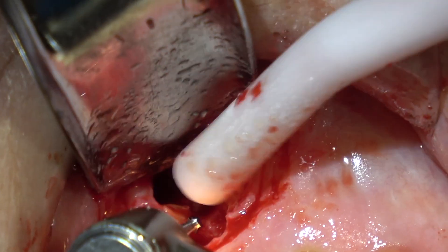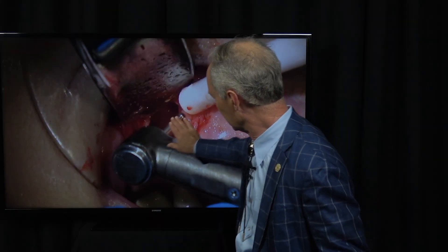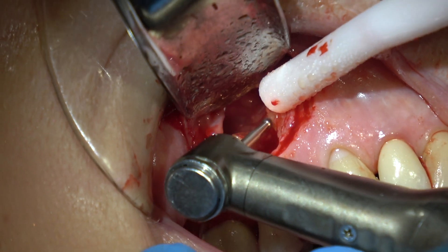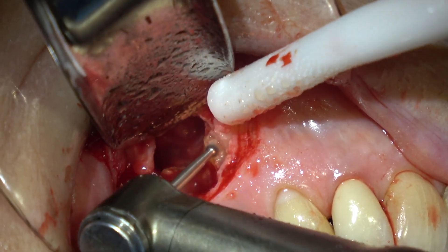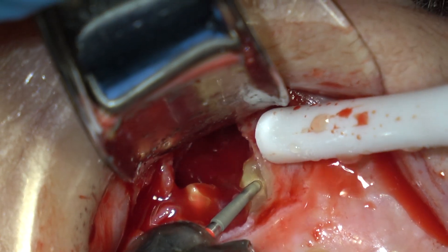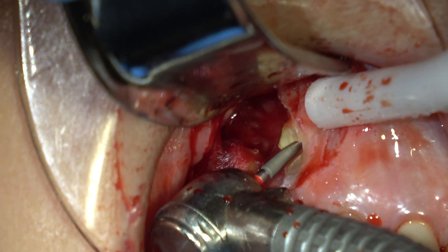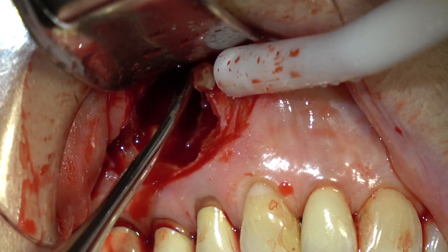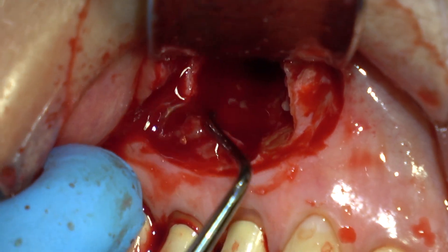Now I'm flattening this out. Be sure you flatten out — you want to cut the tips of the teeth like this and be sure you can get behind them to clean all of that out. I'm removing a little bone coronal to the apex of the teeth, and I'm removing the apical part of both of the roots of these teeth. I believe that's the first bicuspid — I'm taking that out. And then the apical part of the root of the second bicuspid, I'm removing that because that's the source of the infection.